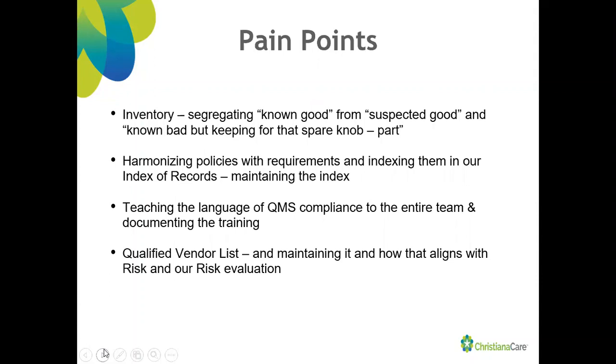When the technician has a device on their workbench, it means they have to keep the work order there so that if an auditor were to walk in, or somebody else were to walk in after hours, maybe security let them in because they were out of pumps and they needed to come find one, and they got let into the shop, well, they know this one is broken. Don't wander back off with it. So keeping things labeled, keeping things segregated has allowed us to attach a level of quality to that flow of parts.